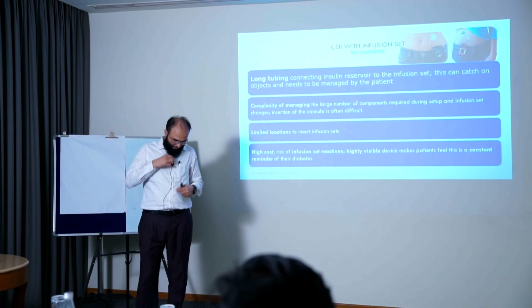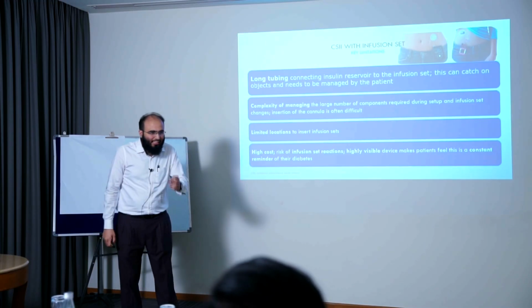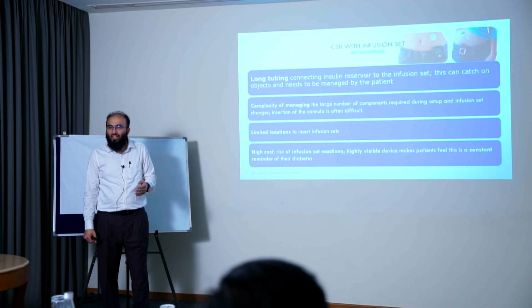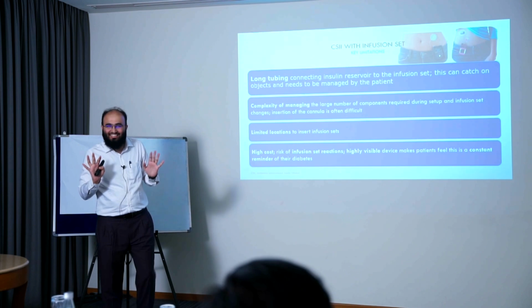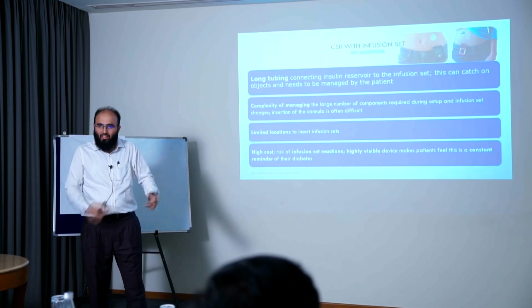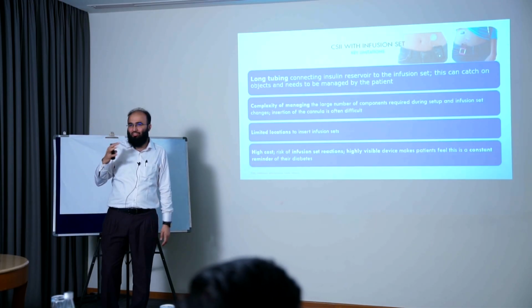And when the pump is attached here, he goes anywhere. People ask him, is that a hearing aid? What is that? What is this? Okay, he gets admitted to an ICU. Our critical care colleagues might not know how to operate a pump. They say, no, you remove it, we will manage it. We will manage your sugars. So he goes to an MRI. They're like, is it compatible? You transmitter nikal do, kuch hua to aapko nahi bola. So it is a constant reminder for the patient.